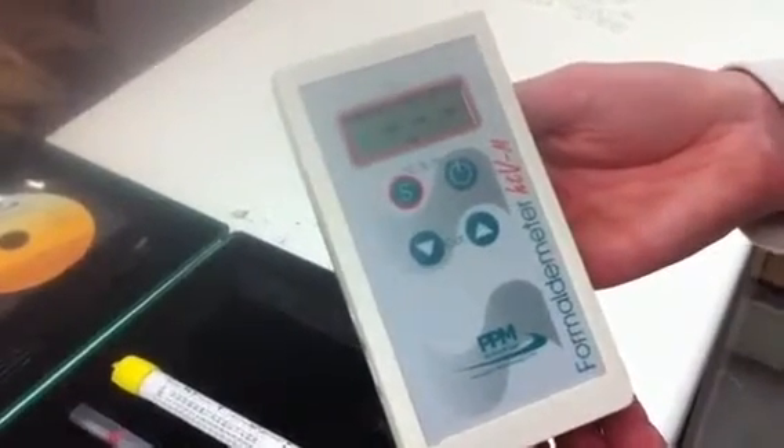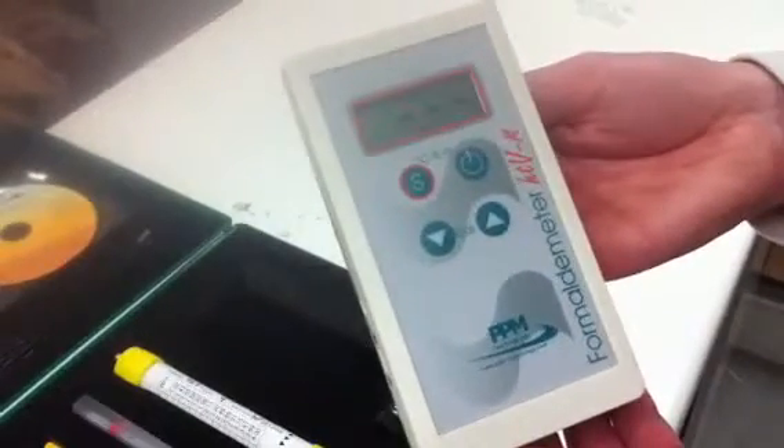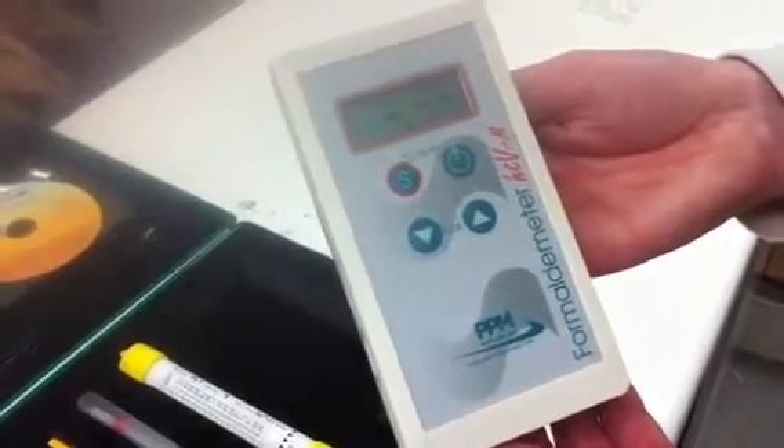The formaldehyde concentration will appear on display in about 60 seconds.